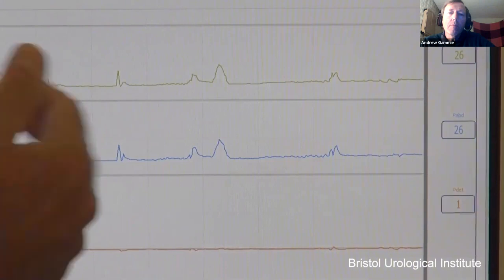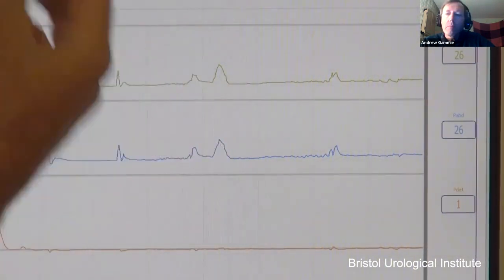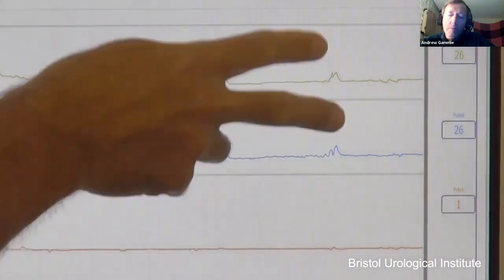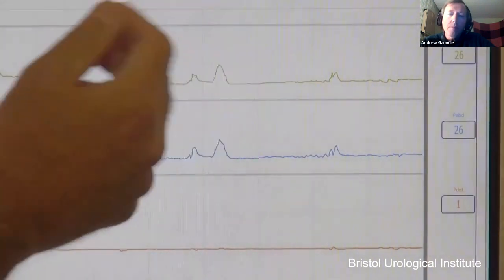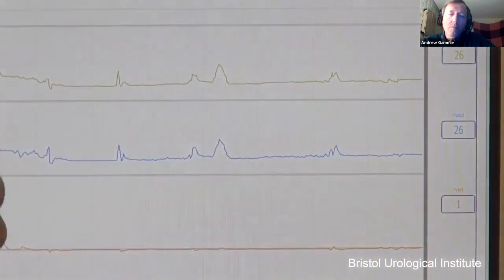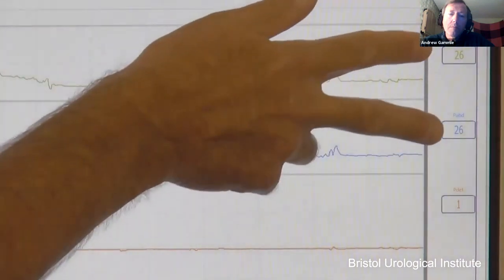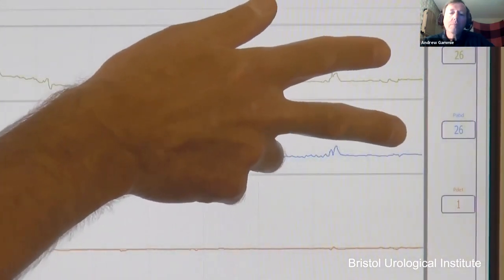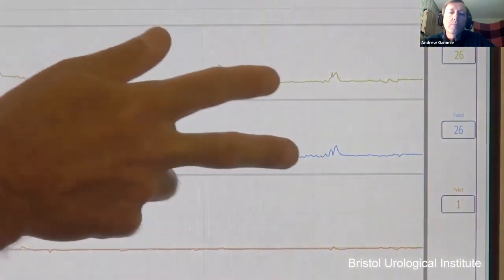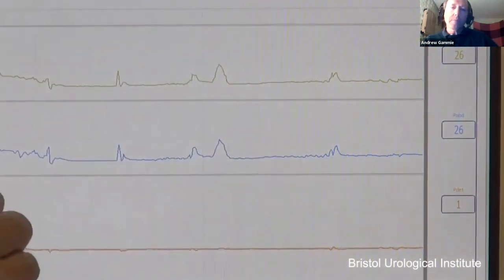And throughout the study, we would ask that the patient does a small Valsalva or exhalation and another cough, probably every minute or two, so that we can verify that pressure is being picked up still. And throughout, we would also measure those other tests of quality, the resting pressures and the live signal. If those continue throughout the test, you're confident of a good quality recording.